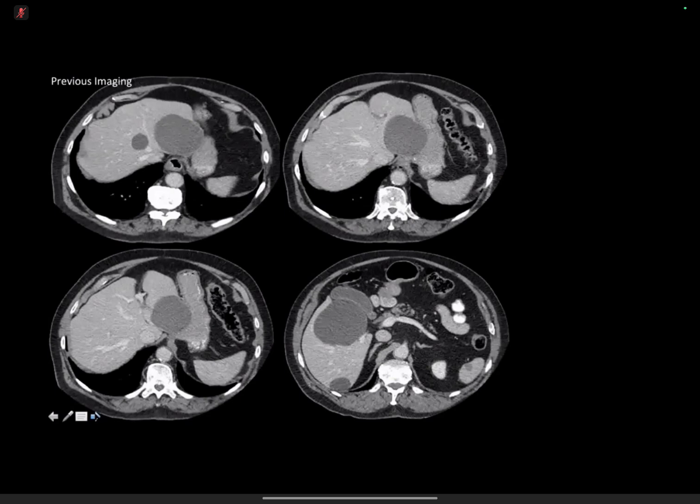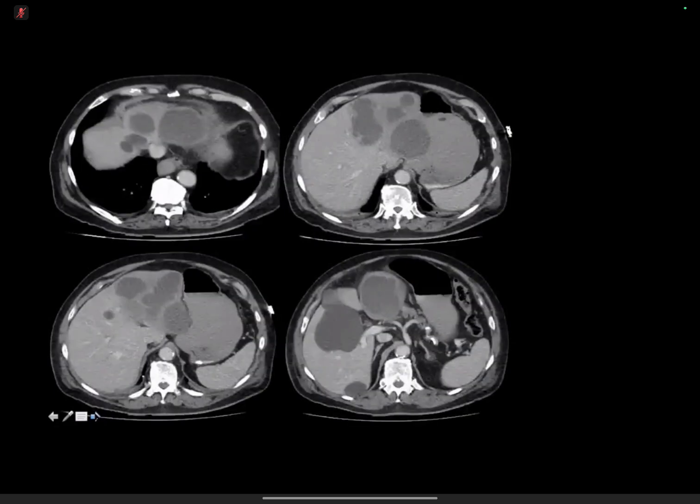Okay, so the patient already had multiple hepatic cysts, and they look quite simple on those images. And now there are new lesions that weren't previously seen, which, as I said before, are generally low density, a little bit irregular around the edges. My primary differential remains that these have been acquired since the previous imaging.